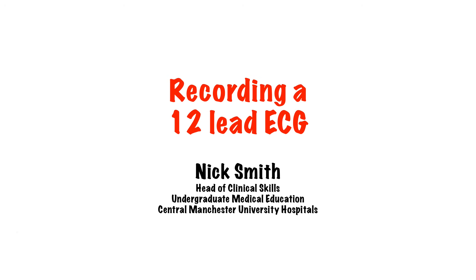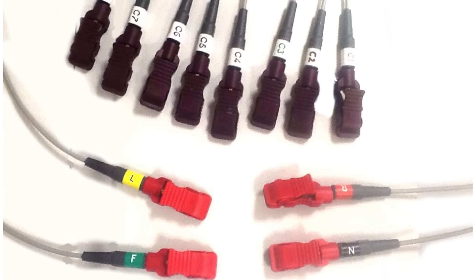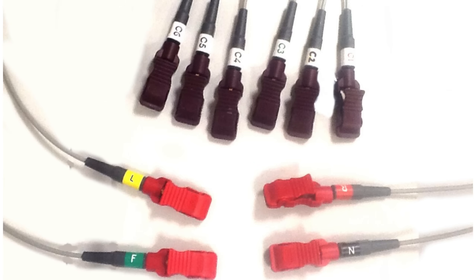Hello, my name is Nick, and welcome to this short video on recording a 12-lead ECG. The first thing to point out is that although it's called a 12-lead ECG, there are in fact only 10 physical leads to put on, so don't go looking for two more.